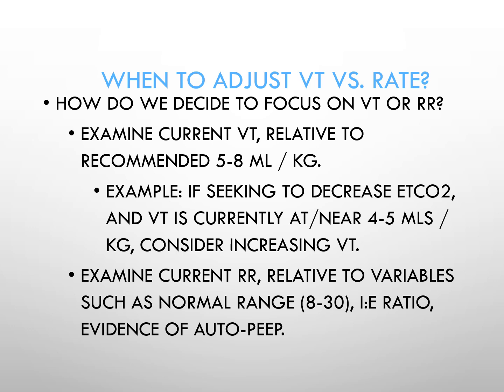So again, in this particular slide, this example is really looking at, if you're seeking to decrease the end-tidal CO2 or the CO2 that's in the serum, and the tidal volume is currently at that lower end of 4 to 5 mLs per kg, then consider increasing it, subject to maintaining your plateau pressures less than or equal to 30, or your driving pressures less than 15.